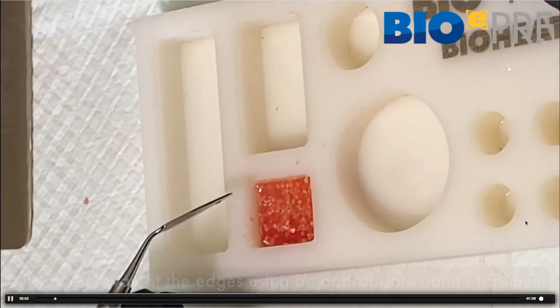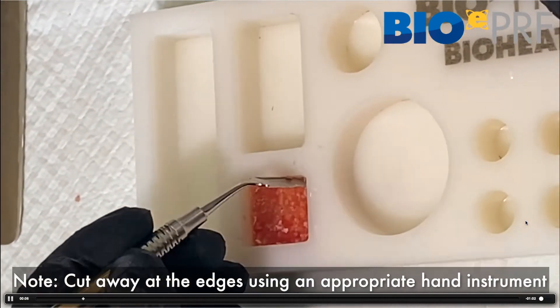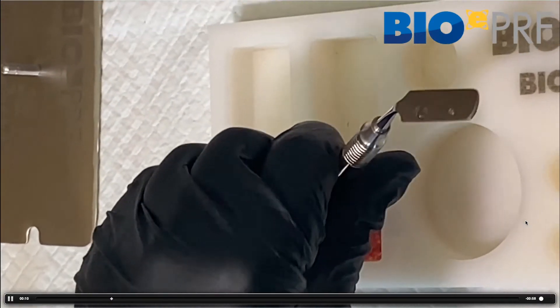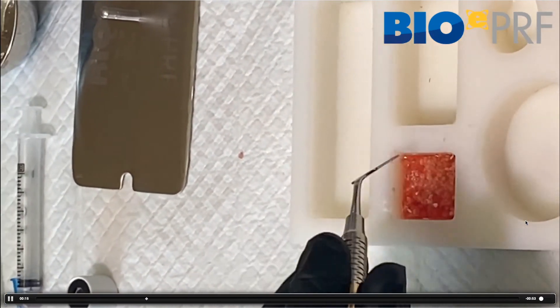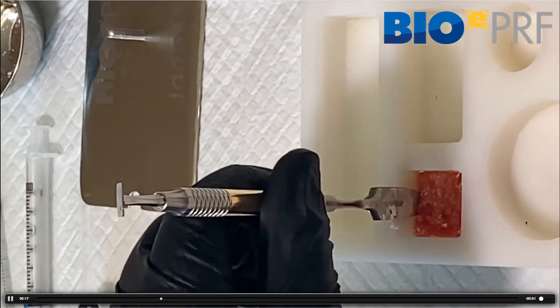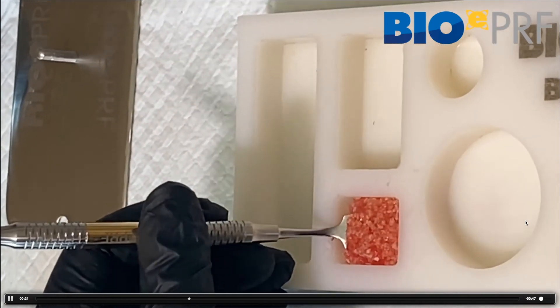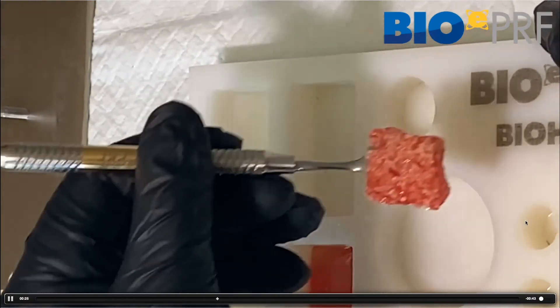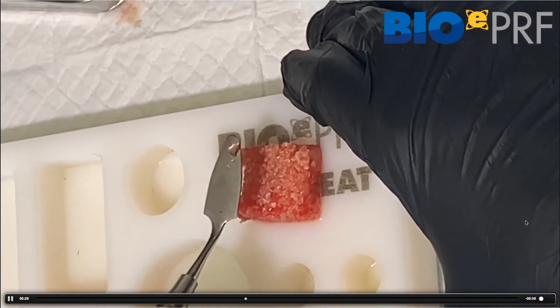When we take this out, it's the same thing — cut away at the edges. A mistake people make is trying to take this out after a minute; this requires probably 10 to 15 minutes. Do it early in your surgical procedures. When you take it out, you'll get something that looks like this, and then you can shape it or cut it, do whatever you want with it.